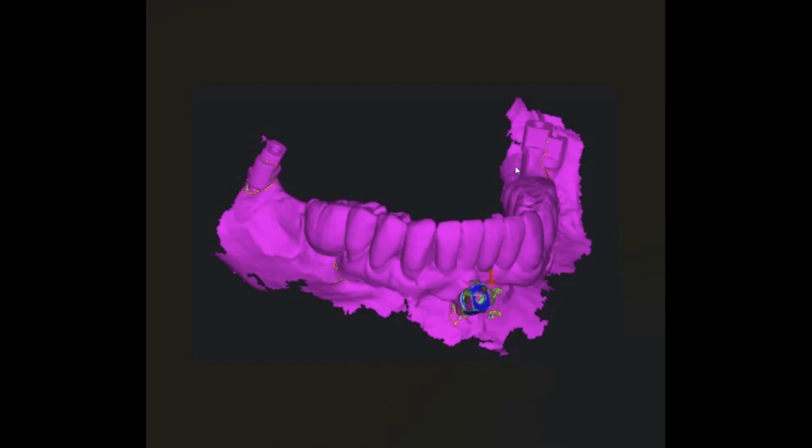I was my own designer from 2011, 12 to 18 before I hired a designer. I know the limitations of intraoral scanning. At best you get 50 microns of deviation. And oftentimes you get 400, 500, 600 microns. Depends on the camera, depends on the technique, depends on the mobile tissue, the amount of blood, all that. The technique being probably the most important, and the camera. All right, so there are many reasons why this midline fiducial technique that we developed at the Atlantic Implant Institute is the way to go.